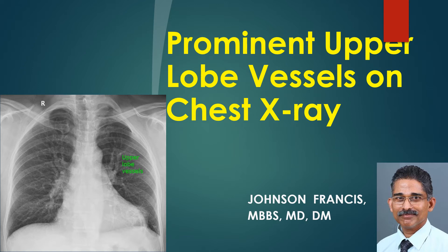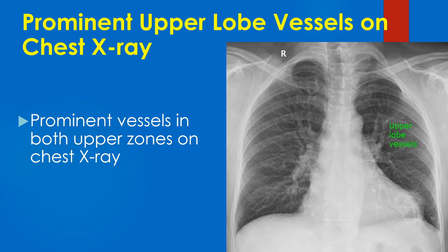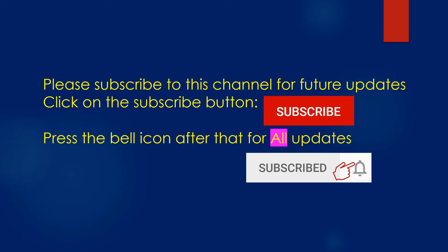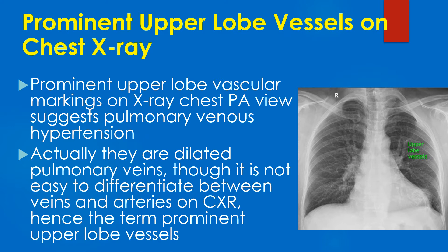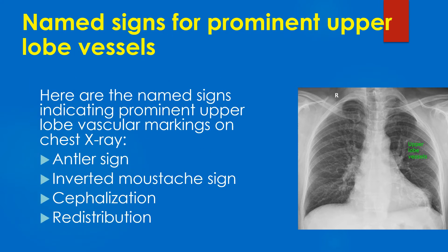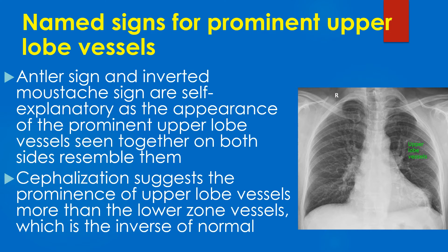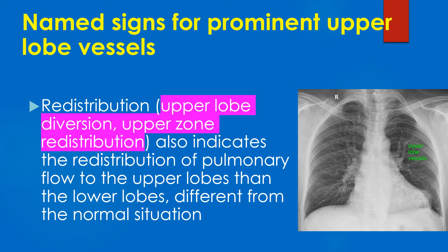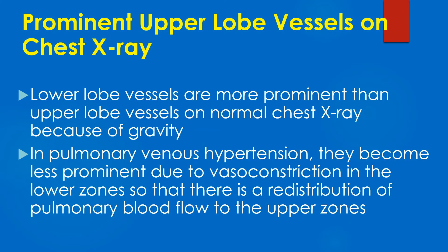Here is a short discussion on prominent upper lobe vessels on chest x-ray. Redistribution, also known as upper lobe diversion, indicates redistribution of pulmonary blood flow to the upper lobes rather than the lower lobes, which is different from the normal situation. Lower lobe vessels are more prominent than upper lobe vessels on a normal chest x-ray because of gravity.